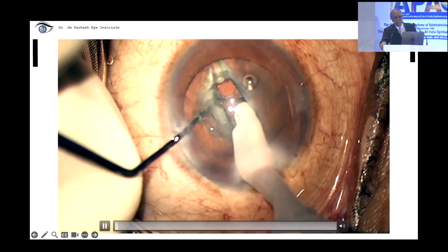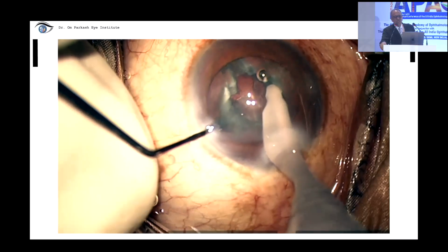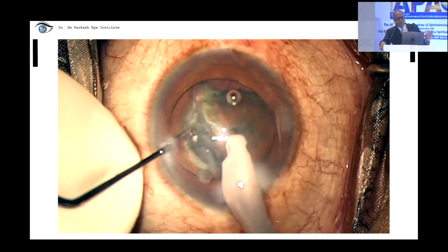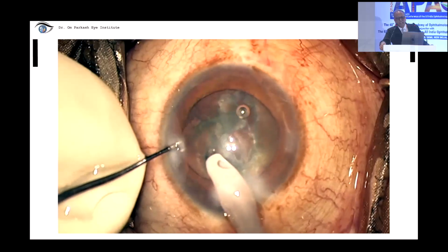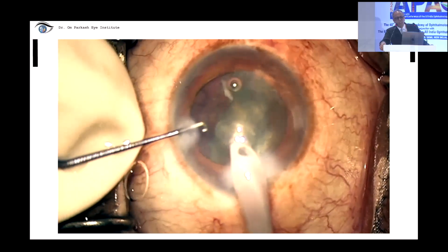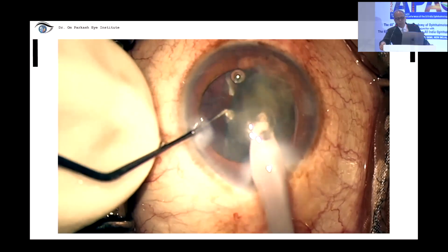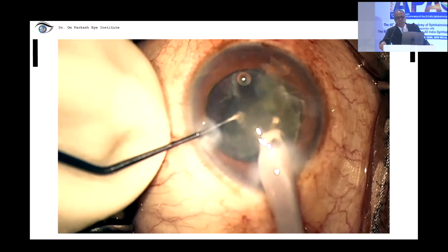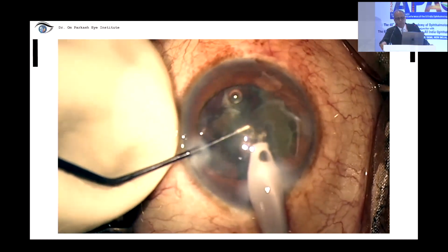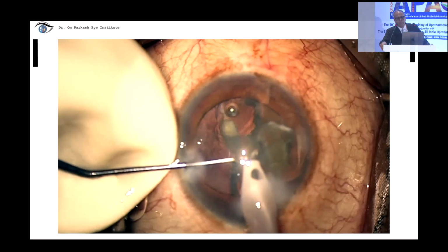So the patient was shifted. I did separation, not extensive separation. Since hydrodissection had been done, it had been separated. I did exactly what David said, tried to pull it out, which I was able to because the adhesions in this grade 2 cataract were not that profound. Did supracapsular emulsification in this soft cataract, and the phacoemulsification was completed for one heminucleus.